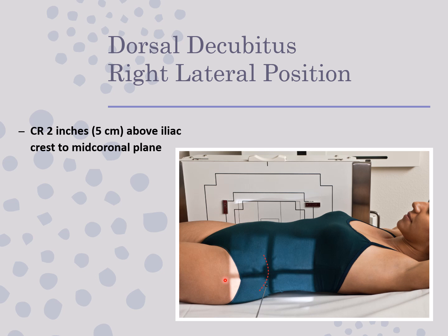In the book, this one right here, she has her right side against the board, and you can see right here they have the right marker. So she's lying in a right lateral dorsal decube. I know, it's a lot of words.